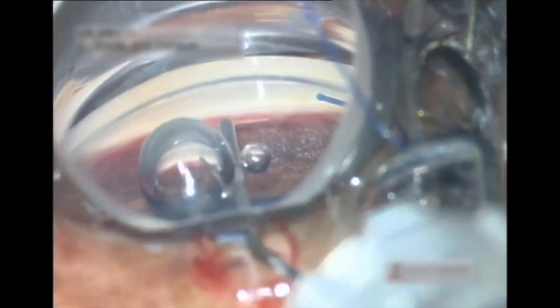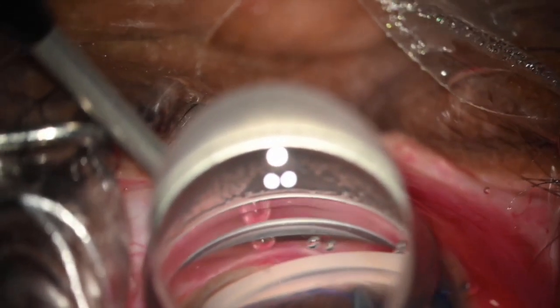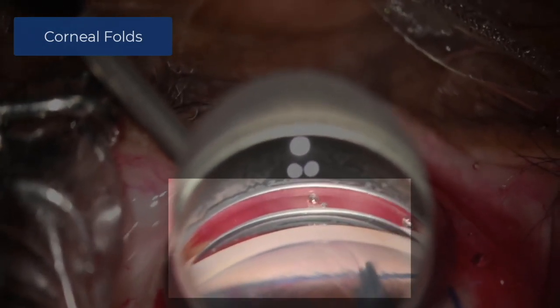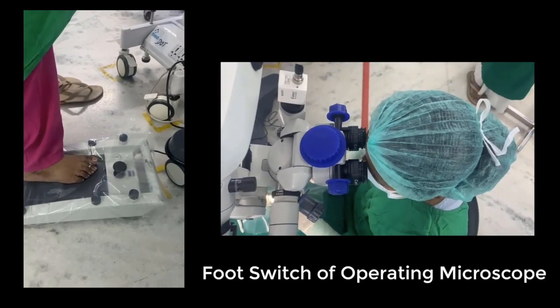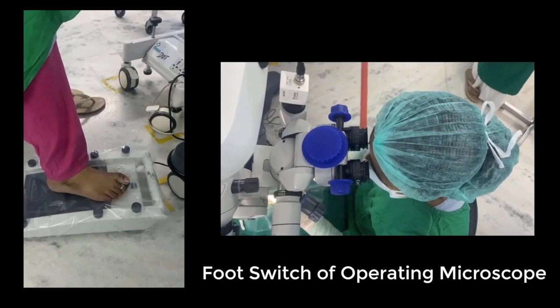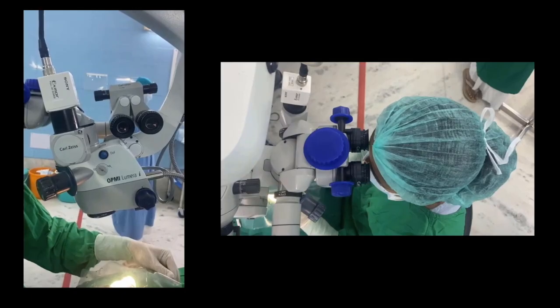Initially, during intraoperative gonioscopy, one will have air bubbles in the anterior chamber or too much pressure over the eye while placing the gonio lens, which can result in folds over the cornea and failure to see the angle properly. It takes a few cases to master this technique to visualize the angle perfectly. It will also be good to routinely practice the foot switch of the operating microscope, as both hands get engaged while doing MIGS, so finer adjustments need to be done using the microscope foot switch.